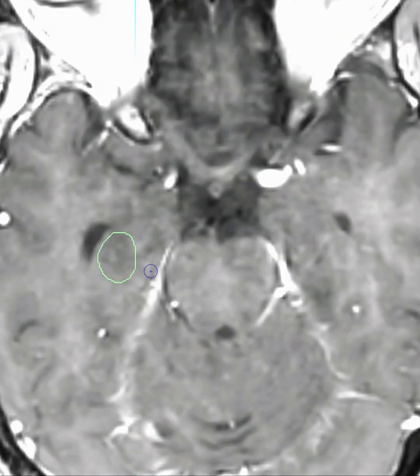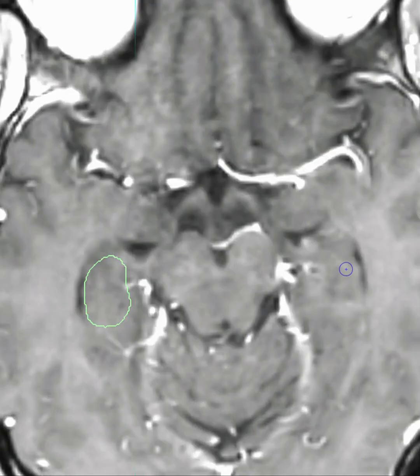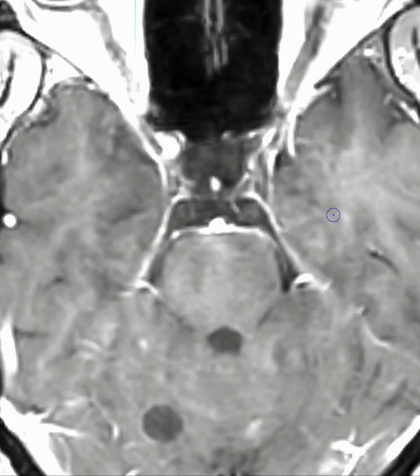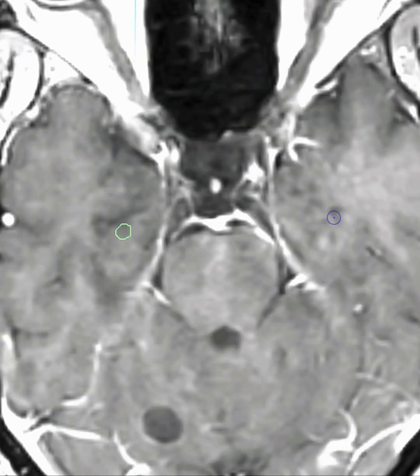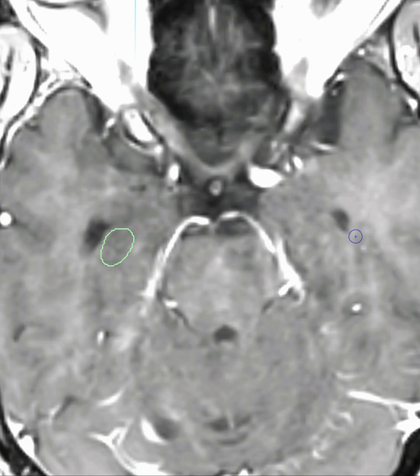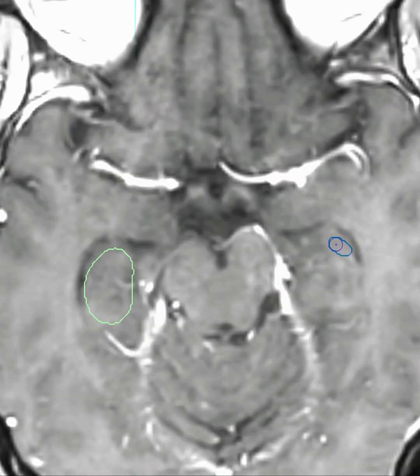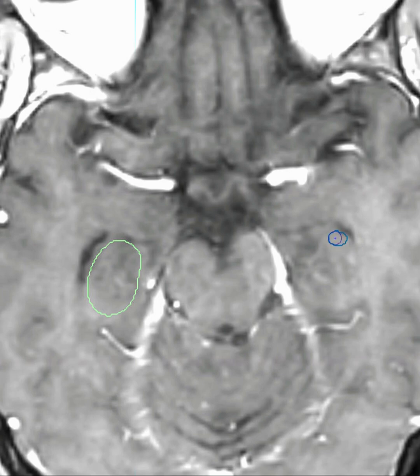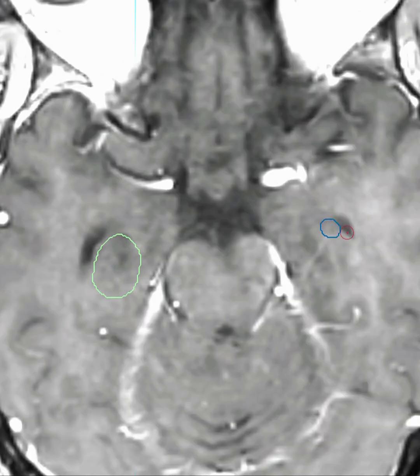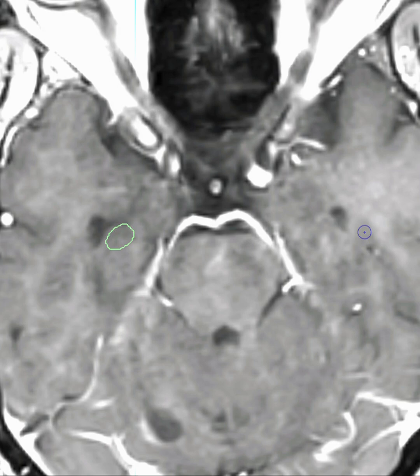That's my hippocampus. We'll do the same thing on the other side — again, go down to the horn of the lateral ventricle. You're looking for a dark gray; this one is very hard to see, but I can see it here. You just need to find your starting point.